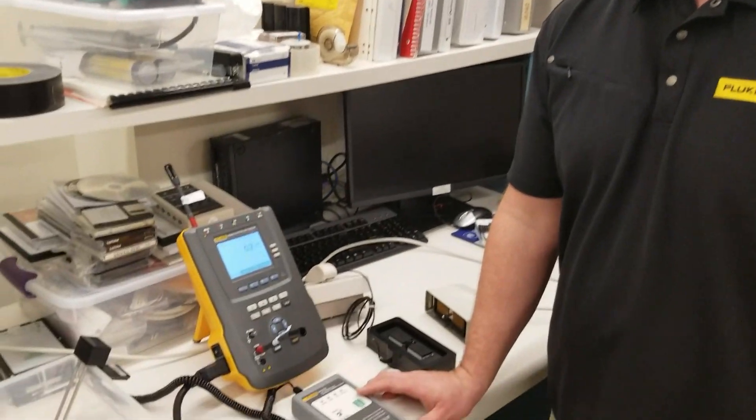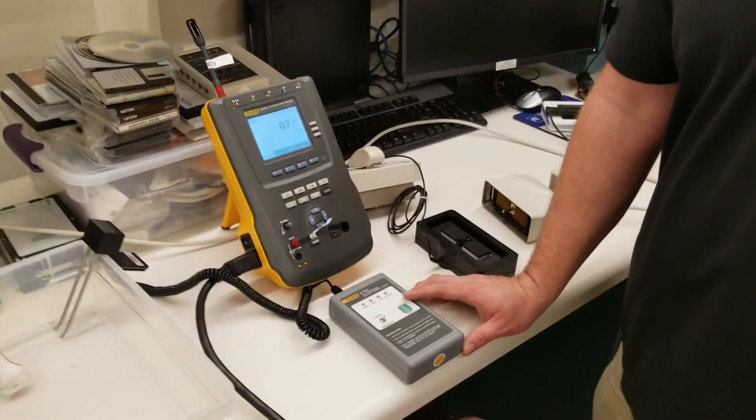Hello, today we're going to work with the ULT 800 and the ESA 612 or 615 to show you how to get exact leakages from an ultrasound probe.